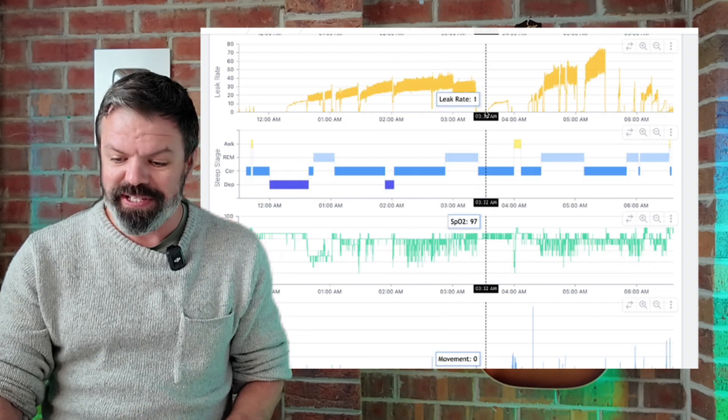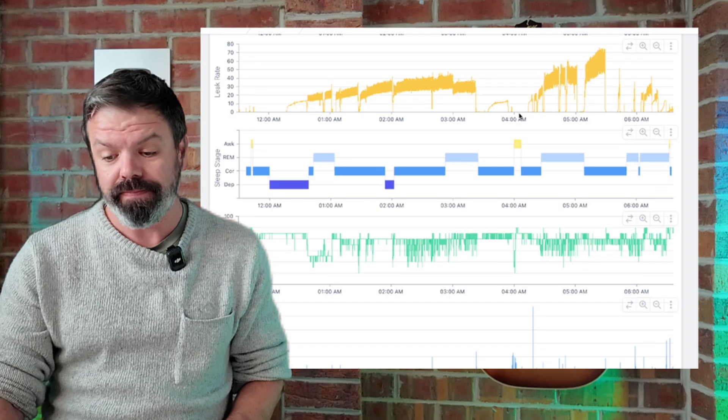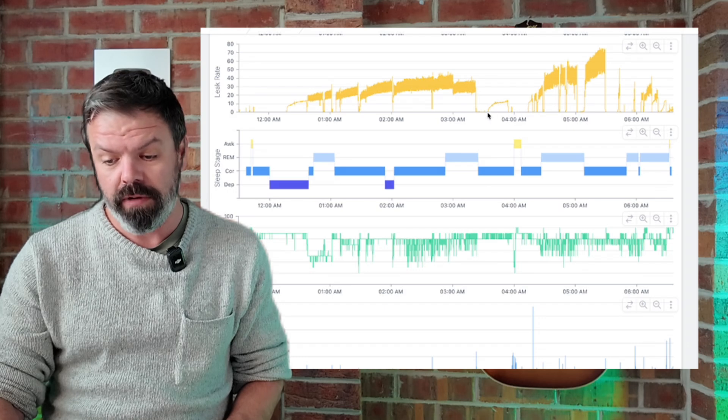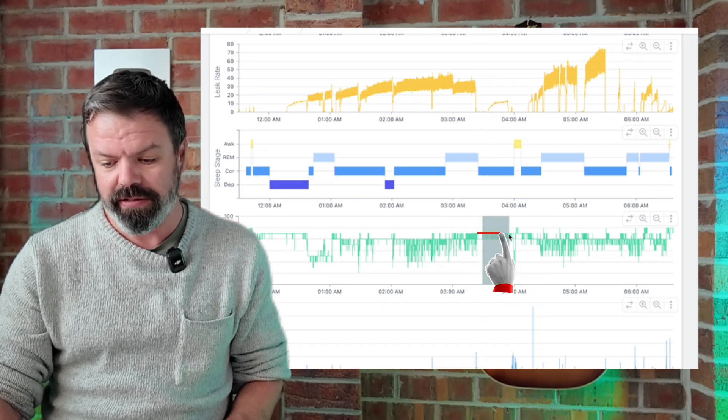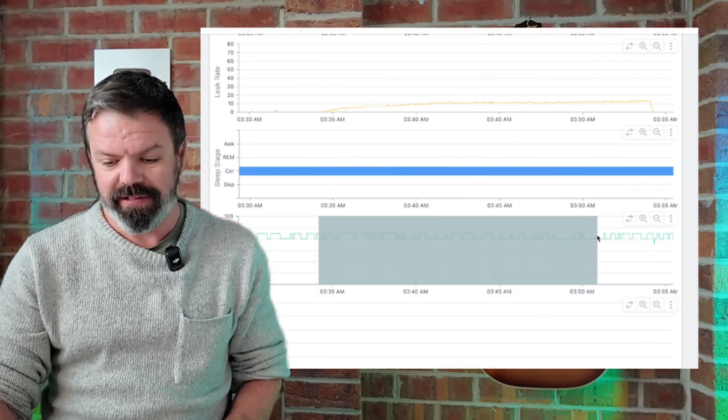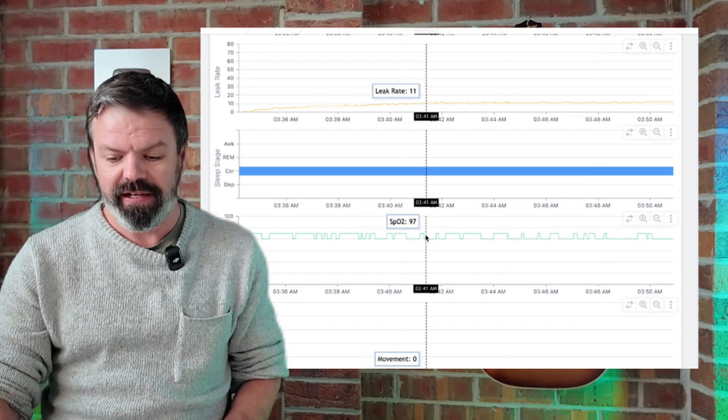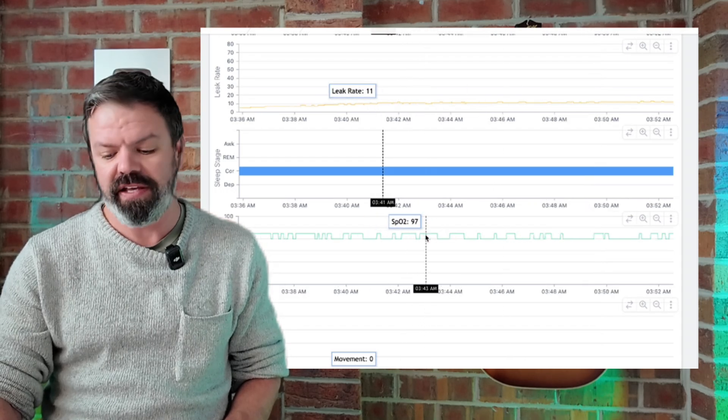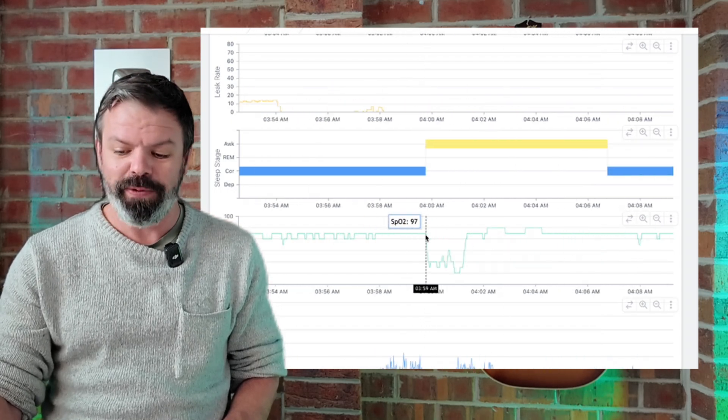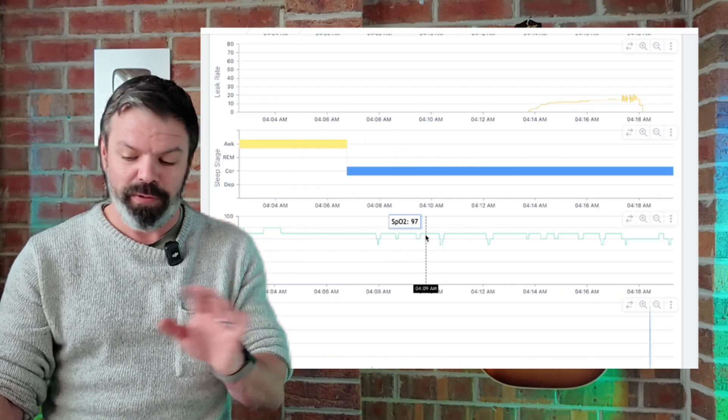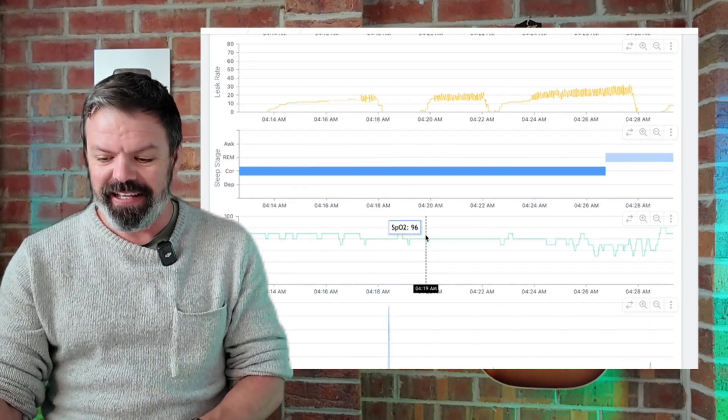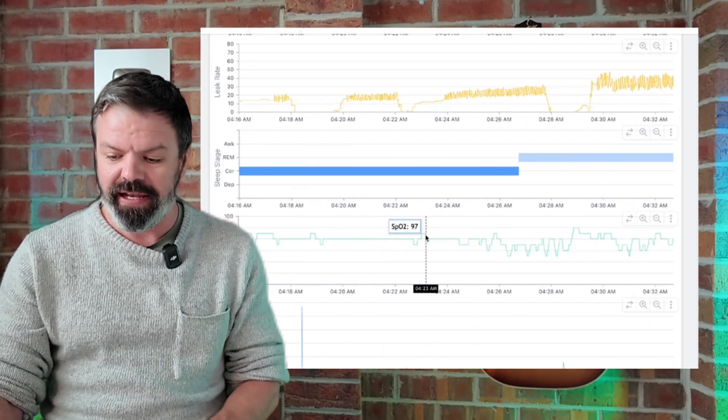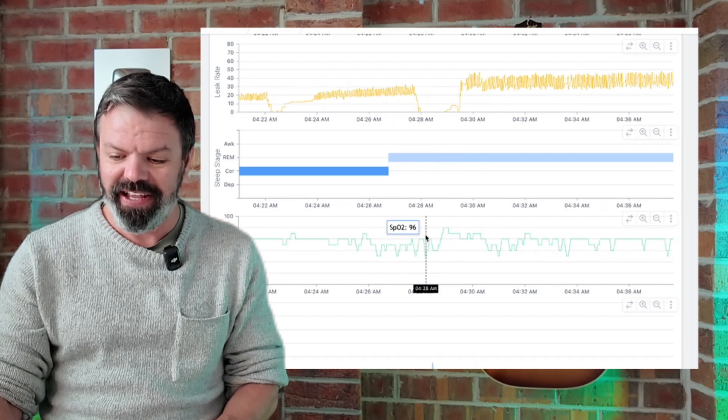Now leak drops here back down to zero. Only a small amount of leak, and look at the O2 now. Yeah, 96, 97. Scroll forward a bit. Here we go. Here comes the leak again. Here it is.